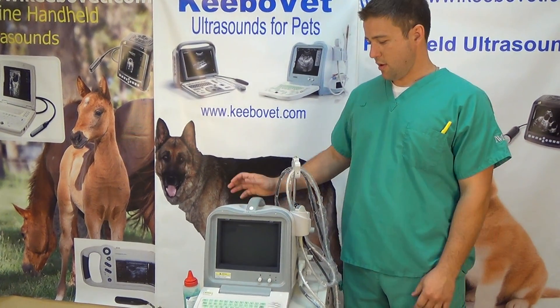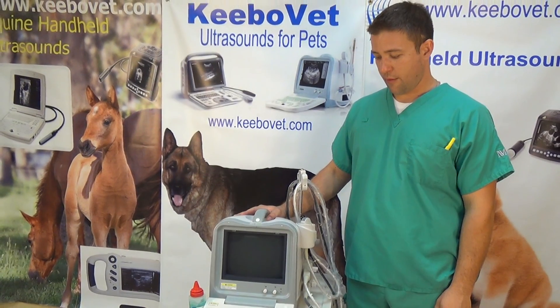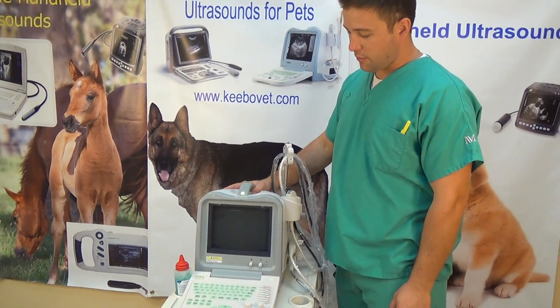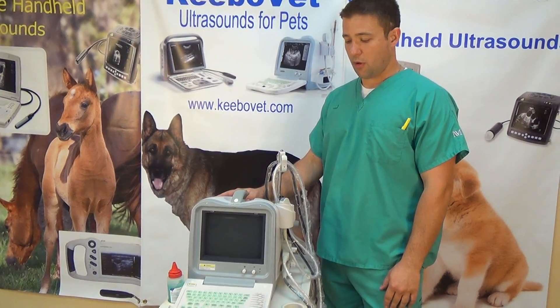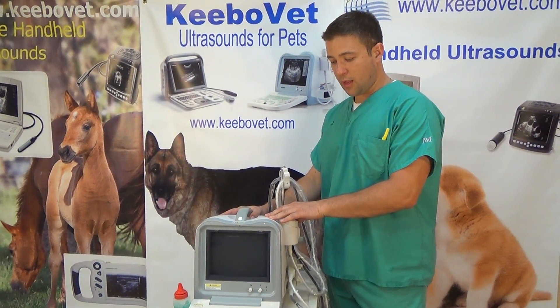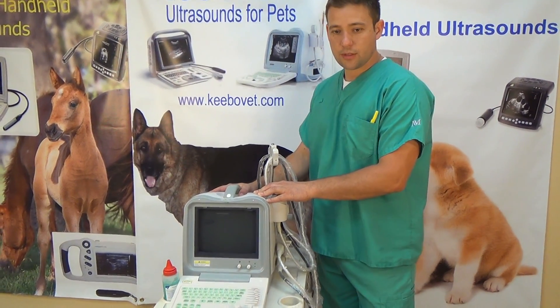Hello, my name is Theo. I'm here to introduce the model KX2600KV for Keebovet. This is a pretty general use ultrasound machine that can be used for both large and small animals. It has the ability to take four different probes and is ideal if your budget is in the $3,000 range or less.